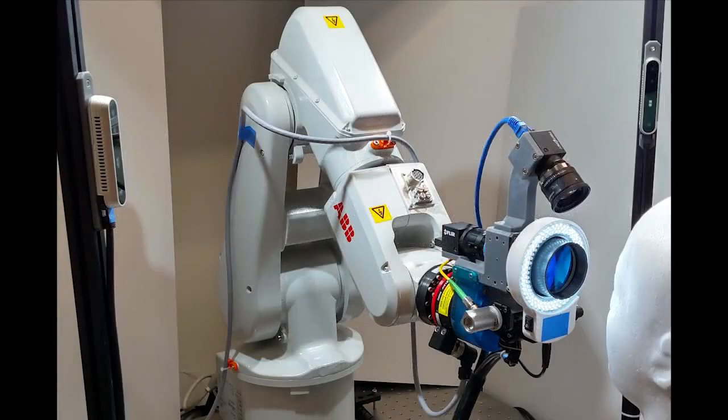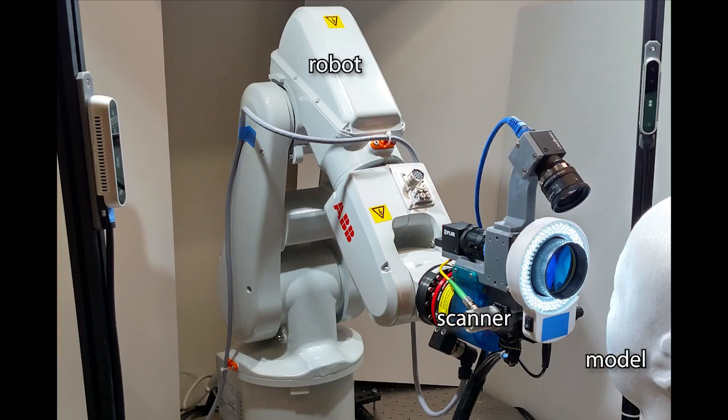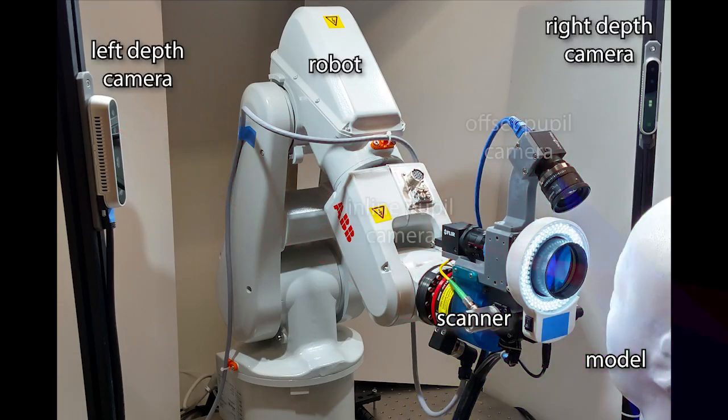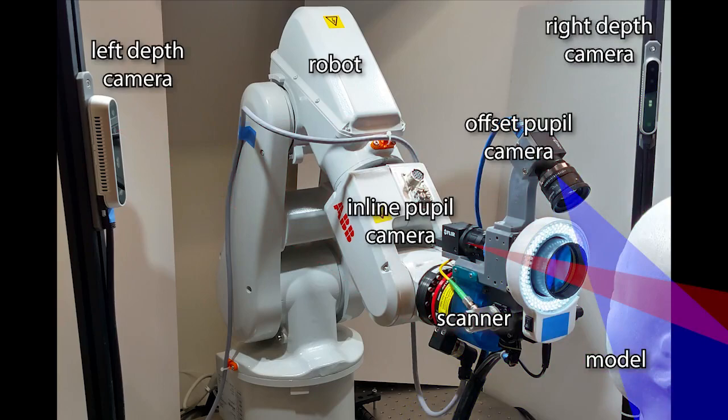This video describes the robotically aligned scanner we developed to automatically acquire optical coherence tomography images of stationary and moving eyes. The system uses two depth cameras for initial gross alignment and two pupil cameras for subsequent fine alignment.